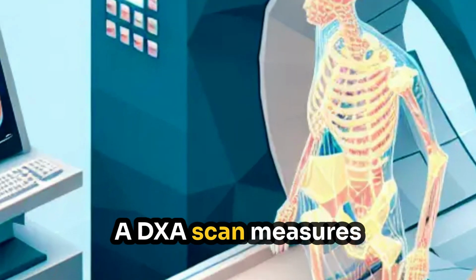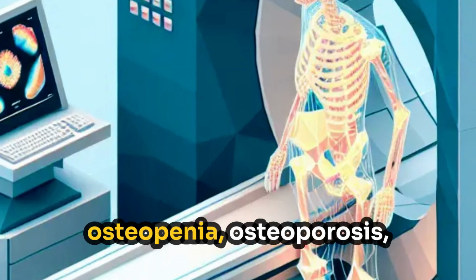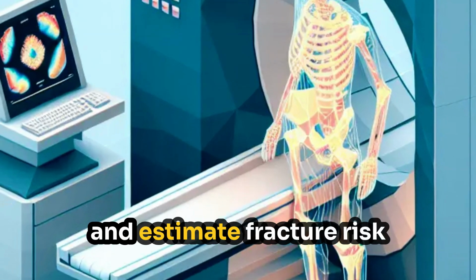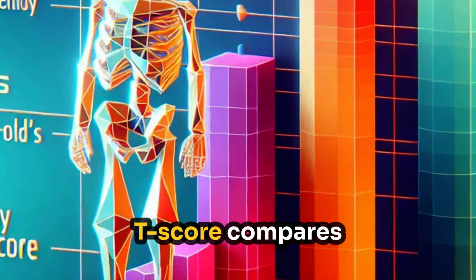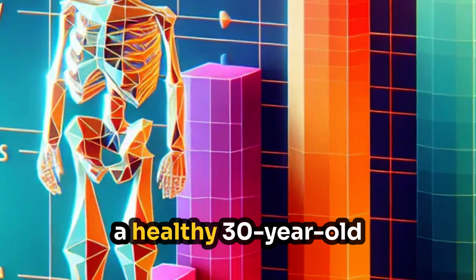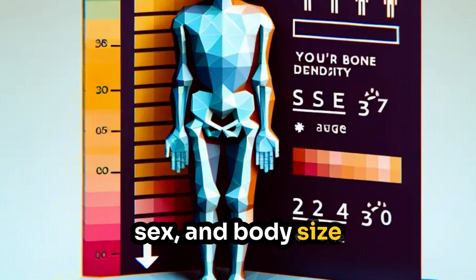A DXA scan measures how dense or strong your bones are. It's used to diagnose osteopenia, osteoporosis, and estimate fracture risk. Two major numbers matter. T-score compares your bone density to a healthy 30-year-old. Z-score compares your bone density to people your own age, sex, and body size.